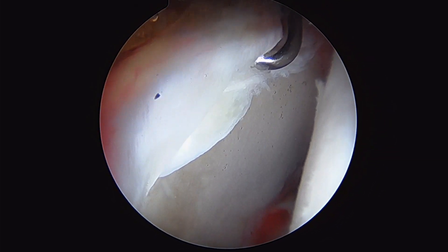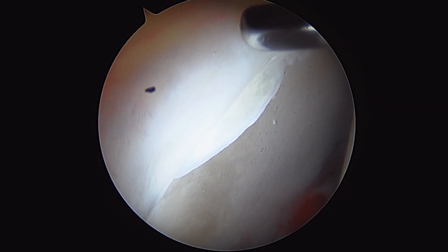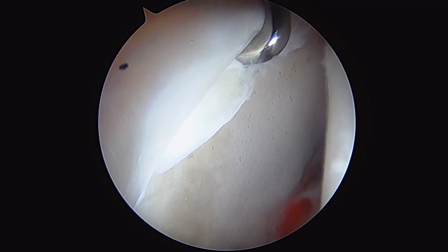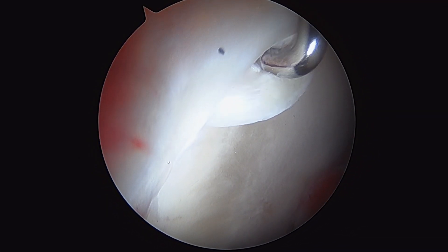What we're looking at here is an anterosuperior labral tear. What I want to show you here is this chondral delamination. This is normal cartilage down in here, but as you can see, as it forms this chondral-labral junction here, you can see the cartilage starting to separate from the rim.